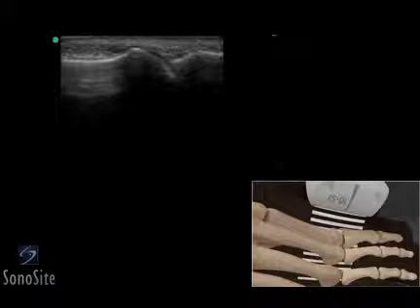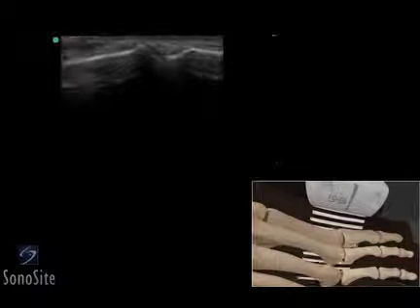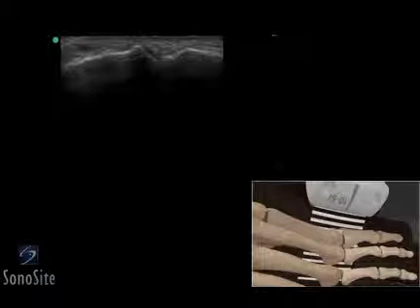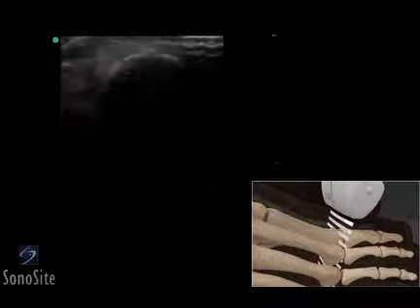The transducer should be slowly moved along the medial surface of the metatarsal phalangeal joint to evaluate the joint space. The transducer is then rotated 90 degrees counterclockwise to obtain a transverse view.